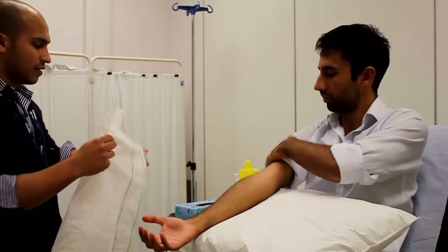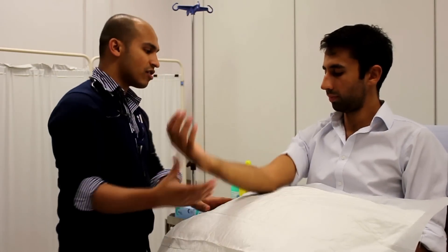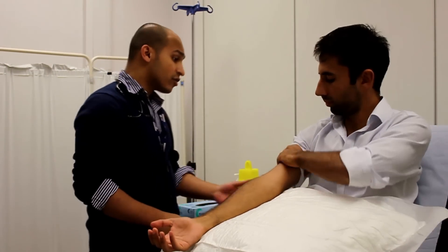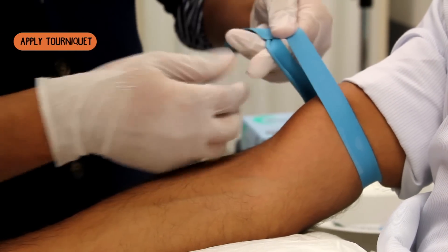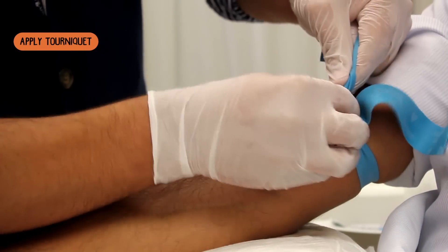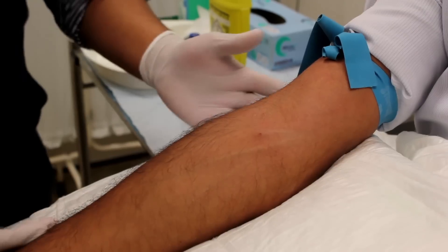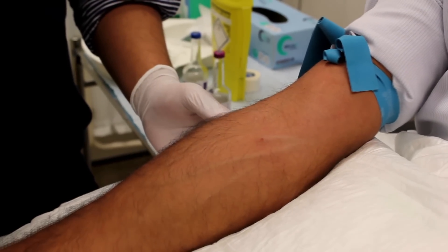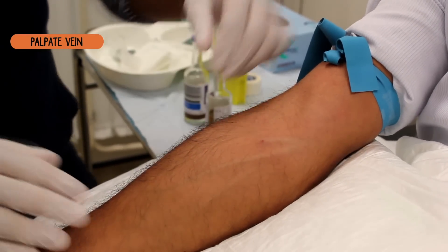I'm just going to place this underneath. I'm just going to put a tourniquet on there, OK? Just squeeze your hand for me a few times — open and close, open and close — and relax your hand for me. Lovely.